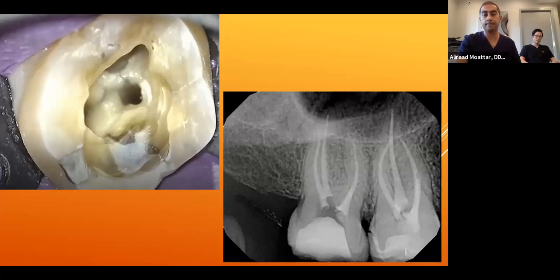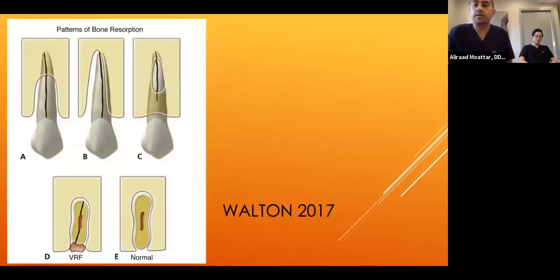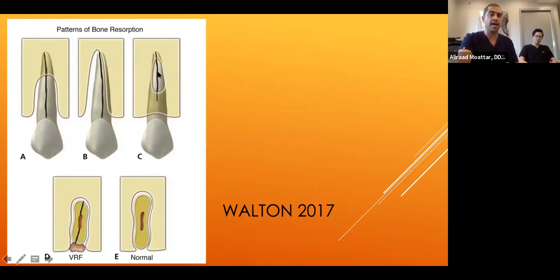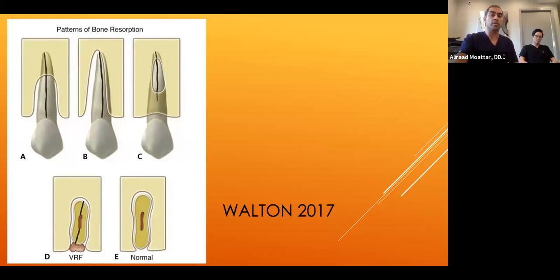Now discussing root fractures, referencing Walton 2017. In root fractures, we look for patterns of bone loss visible even on 2D X-rays: dehiscence in the middle of the root. Root fractures usually start at the middle or apical part of the root and extend coronally, oriented buccolingually.